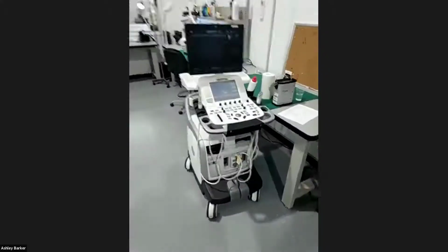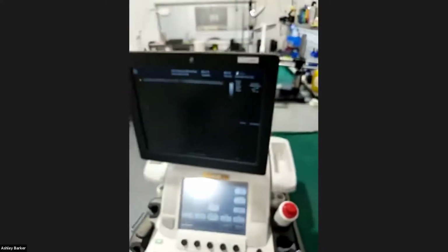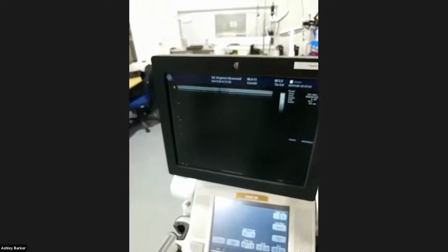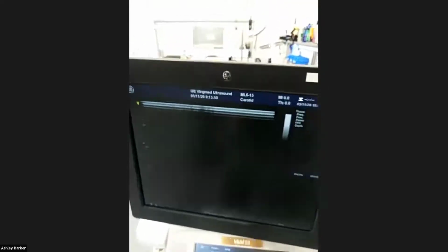And I guess the last thing I thought I'd show you, which is probably pretty obvious to everyone involved, but maybe not, is just looking at this here. So hopefully you can see this ring down image, and it's the simplest way of looking for probe faults. It's definitely not definitive, but when you have your image of your ring down, make sure there's no gel or anything sitting on the probe. You can look along there and you can clearly see the dropout. Now, if you've got big dark lines like that, you really need to get the probe acoustically tested.